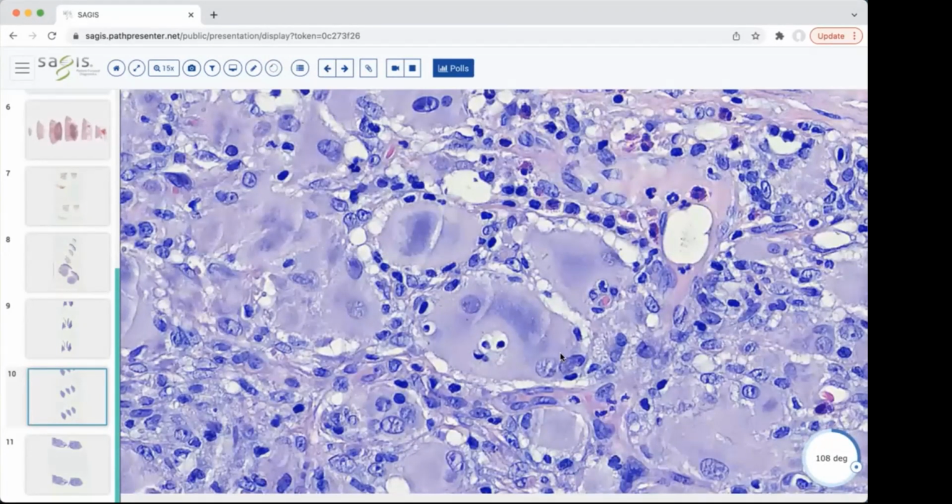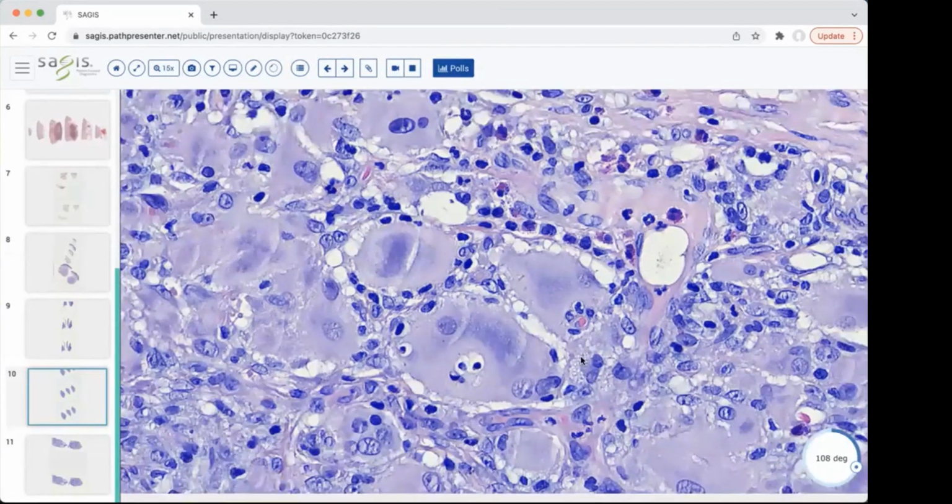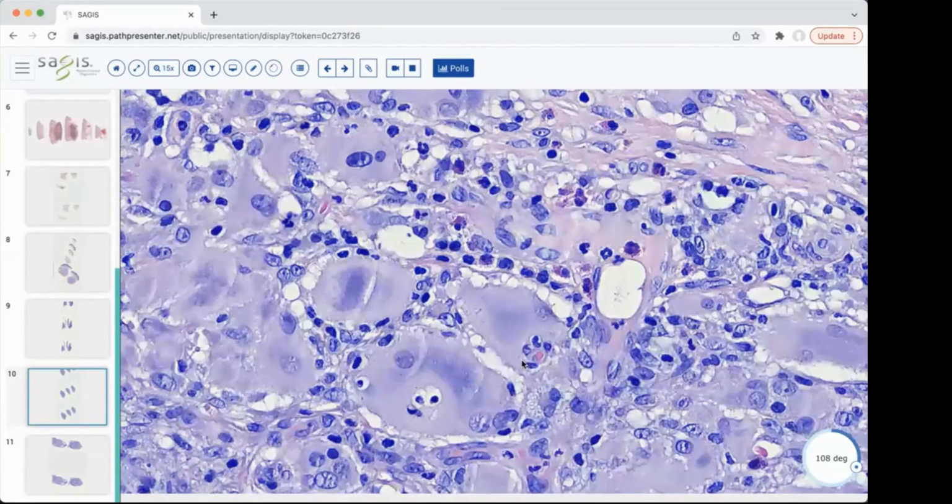And in some books, or even probably some exams, you'll notice that they use the term ground glass to describe the cytoplasm. I guess I can see that. Sometimes that gets overused and is in a lot of places in medicine. But at this high power view, you can see, again, numerous eosinophils, these large foamy cells with two-tone cytoplasm. And just remembering that the lymphocytes, eosinophils, and sometimes even neutrophils scattered throughout here, here and here, is common in this diagnosis.